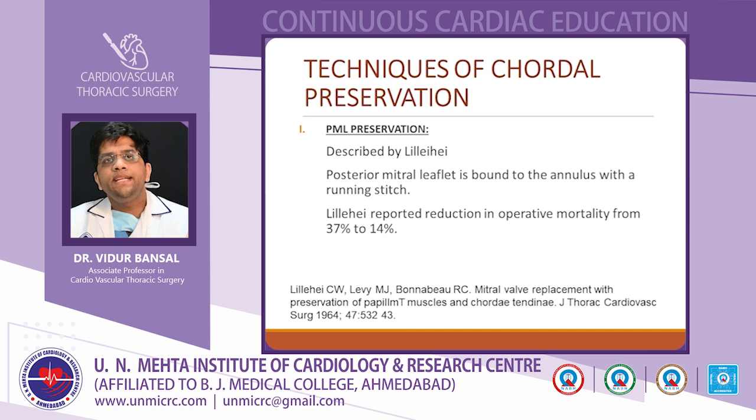Now, coming on to the techniques of chordal preservation, there are various techniques that have been described. So, I'll be covering all the major techniques in brief. First, coming on to the PML preservation, this was described by Lillehei. So, the posterior mitral leaflet is bound to the annulus with a running stitch. This was one of the first techniques that was introduced for chordal preservation, where he preserved the posterior mitral leaflet along with its chordae. So, Lillehei reported a reduction in the operative mortality from 37% to 14%. That was a drastic decline in mortality with preservation of the posterior leaflet.